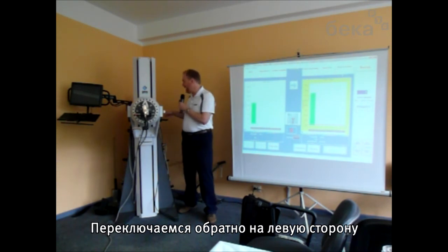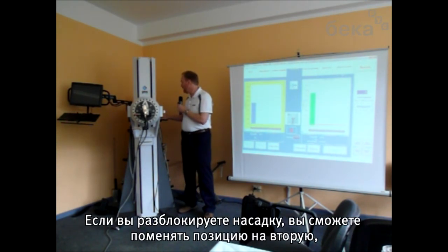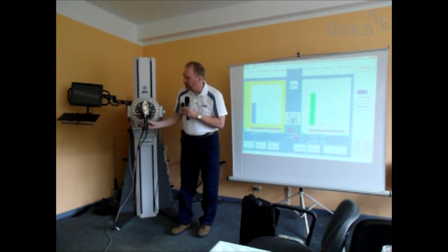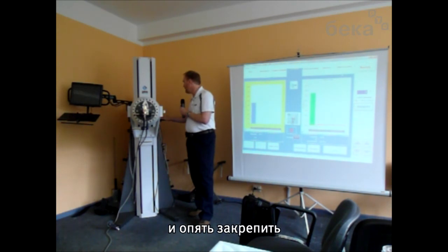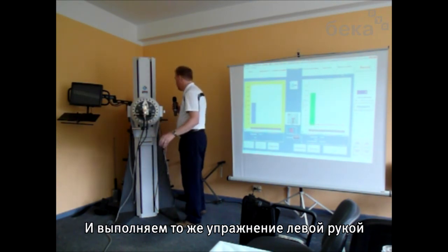And then we're going to switch back to the left side. If you unlock the tool, then that lets you transfer the pin to position number 2, move the handle out to position 2, and then lock it again. And now we'll do the same thing for left-handed.